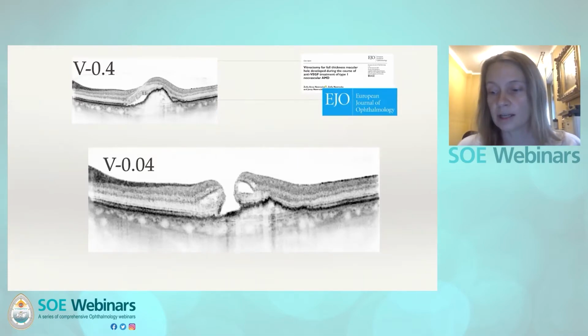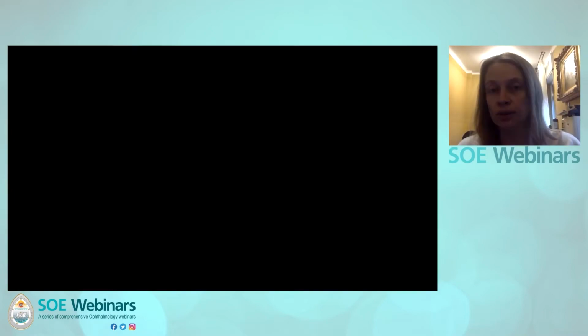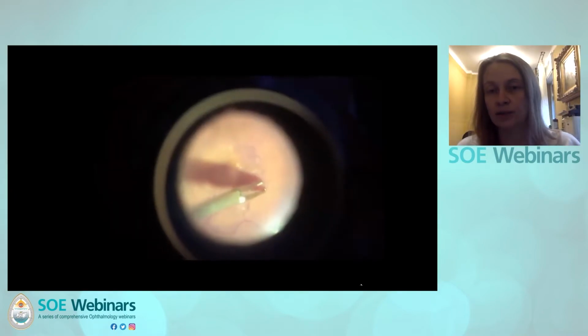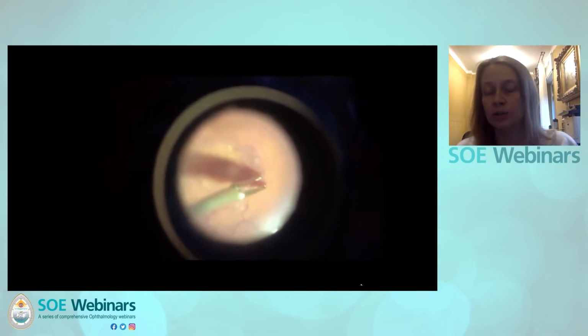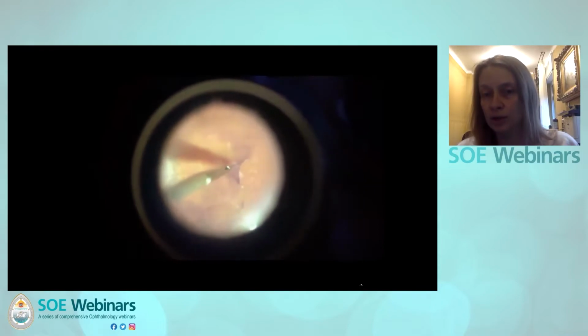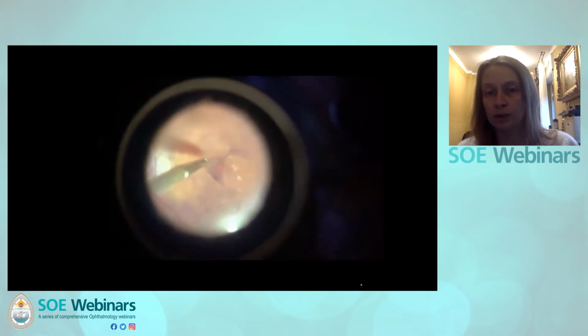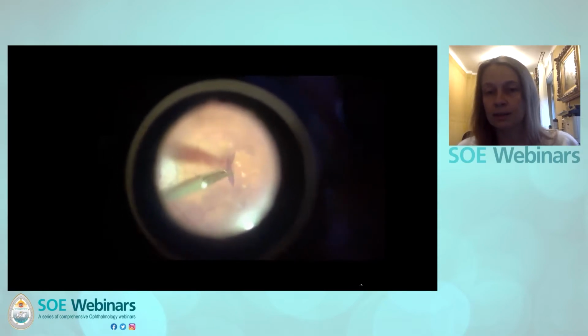During the meantime, we thought about the washout time of anti-VEGF, and based on our studies in endophthalmitis and on the DRCR network that described there is no problem with further anti-VEGF treatment after vitrectomy, we decided to treat this patient. And here you can see a video. This is a patient treated for 10 months with aflibercept, with choroidal neovascularization, some underlying drusen.